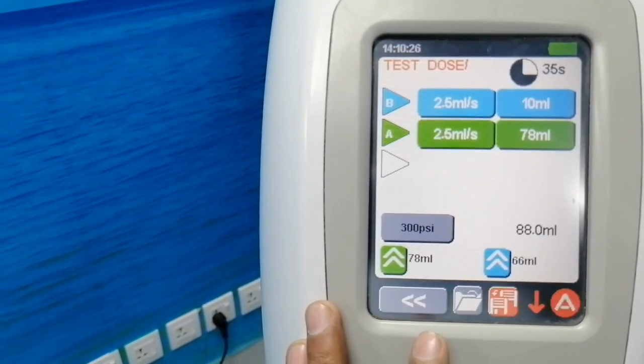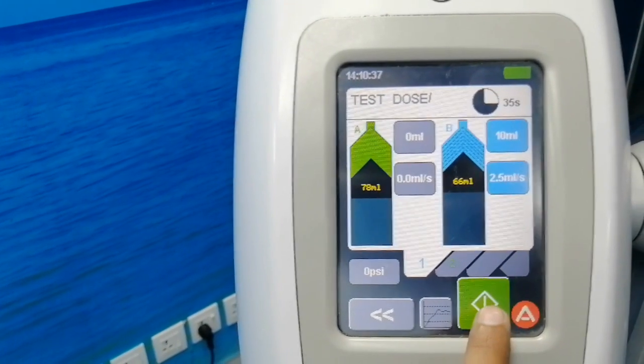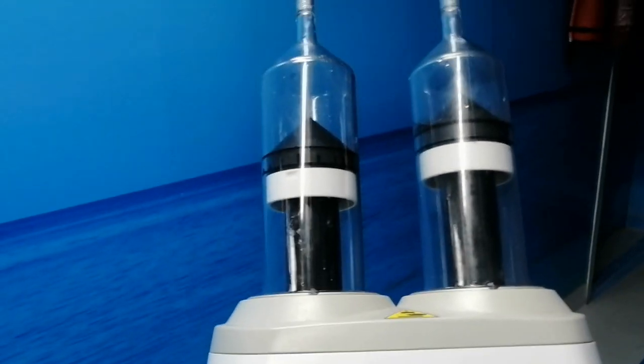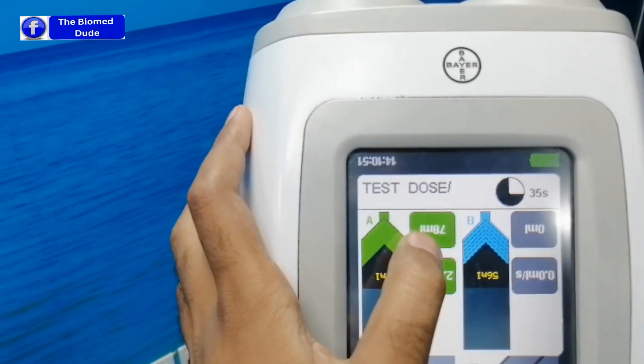Now all settings are done. Again for the procedure — observe these bubbles, then press OK and press the ready switch. Now the contrast injection begins. The contrast is running at a speed of 2.5 ml per second and the total volume is 78 ml.